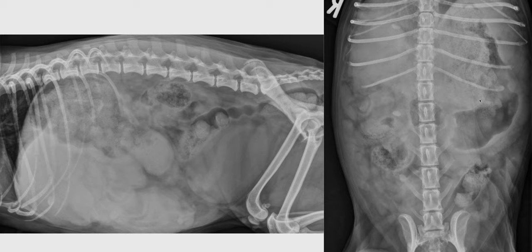Here we see the stomach on the left and on the midline, where normally on a normal dog you should see the fundus here, the body somewhere in the midline, and then the pyloric antrum at that level. So this displacement of the stomach to the left indicates a mass effect coming from the right cranial abdomen.